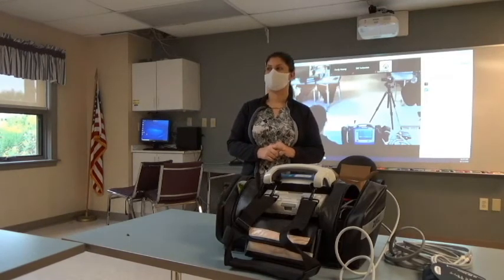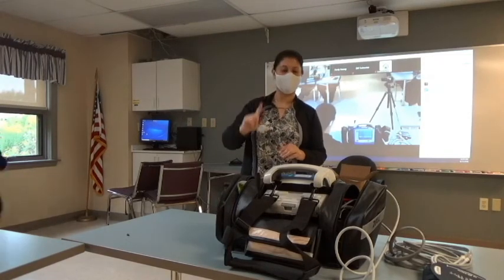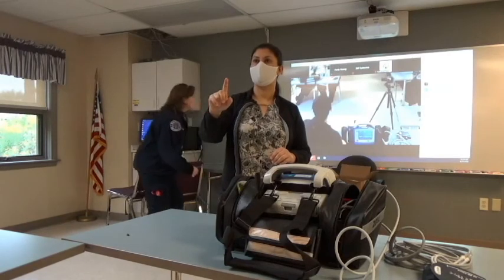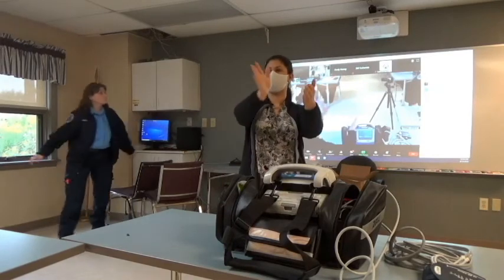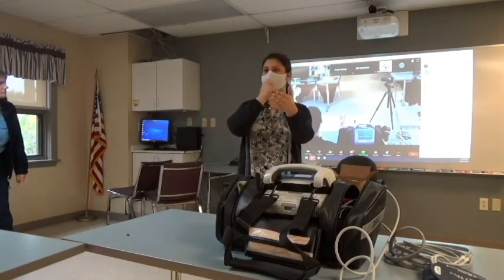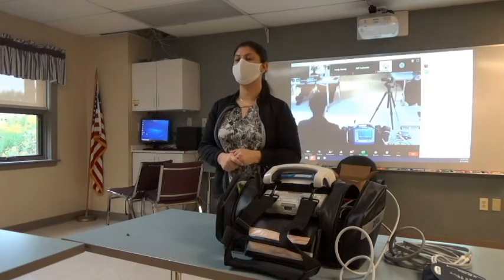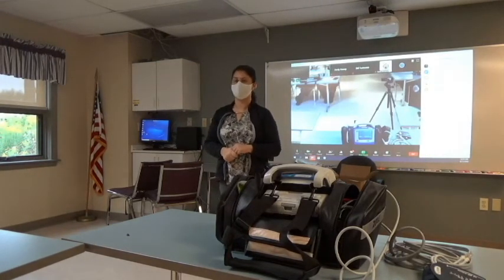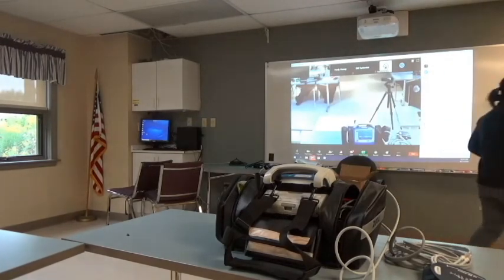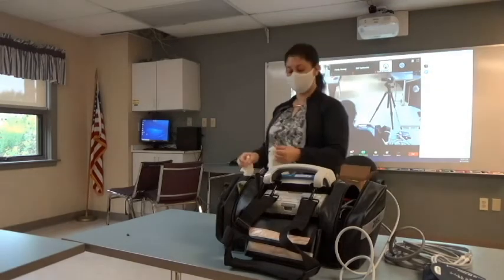Yeah, we went already. We did that. Actually, she went over that. That's okay. Let me show you again. Do I need to be quiet? No, you're good. Okay. So. Did somebody zoom in for the next session? If you take a look at the left side of your device, you're going to find the back arrow keys. Remember that scrolls through the apps on your phone. So if you find the white cross, you get a total of 10 code or event markers, and those are all customizable. Did that answer your question? Yes.